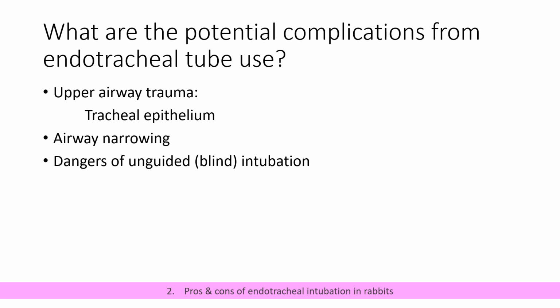Unguided intubation or blind intubation is still a very common technique all the way around the world, and essentially for those of you who've not done it, you're passing the tube into the pharynx, you're listening for breath sounds, and then when you hear breath sounds, you're trying to pass the tube down the larynx. Even for those of us who are good at it, you are still prodding the end of quite a sharp pointed tube around the larynx, and the potential laryngeal trauma there is very significant. And again, it's not really a question of technique. If you are not looking at where the end of the tube is going, the risk of traumatizing the arytenoid cartilages in particular, but also the body of the larynx and the epiglottis, is quite significant.